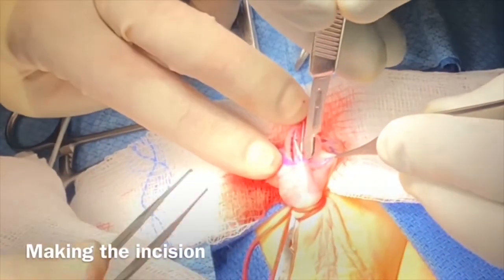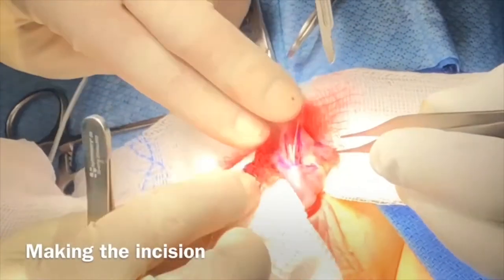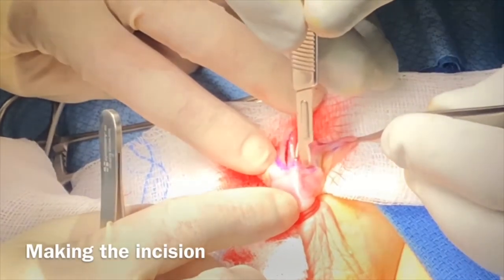Followed by this, the hypospadiac meatal opening is carefully separated from the ventral skin using a 15-blade.